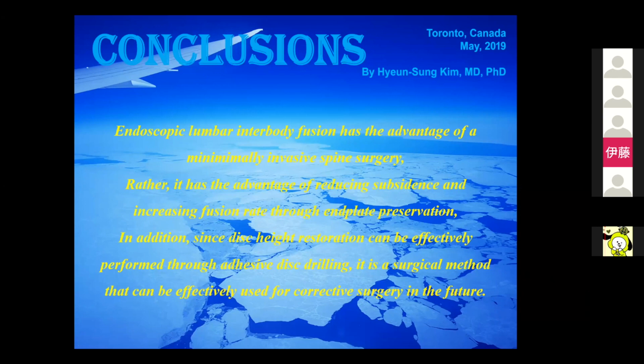In conclusion, endoscopic lumbar interbody fusion has the advantage of minimally invasive spine surgery. Yes, I agree. But rather, it has the advantage of reducing subsidence and increasing the fusion rate through endplate preservation. In addition, since disc height restoration can be effectively performed through adhesive disc drilling, it is a surgical method that can be effectively used for corrective surgery in the future.